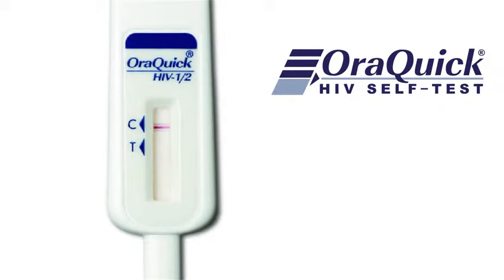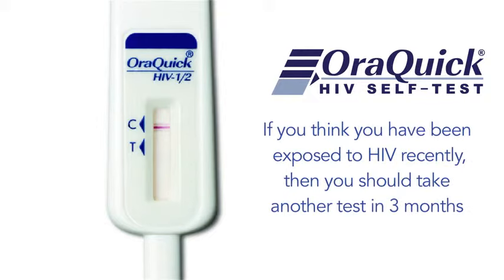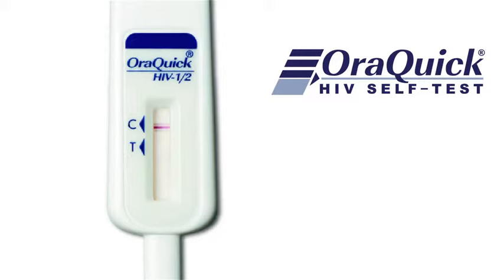If there is one line next to the C and no line next to the T, then your result is negative. However, if you think you have been exposed to HIV recently, then you should take another test in three months.